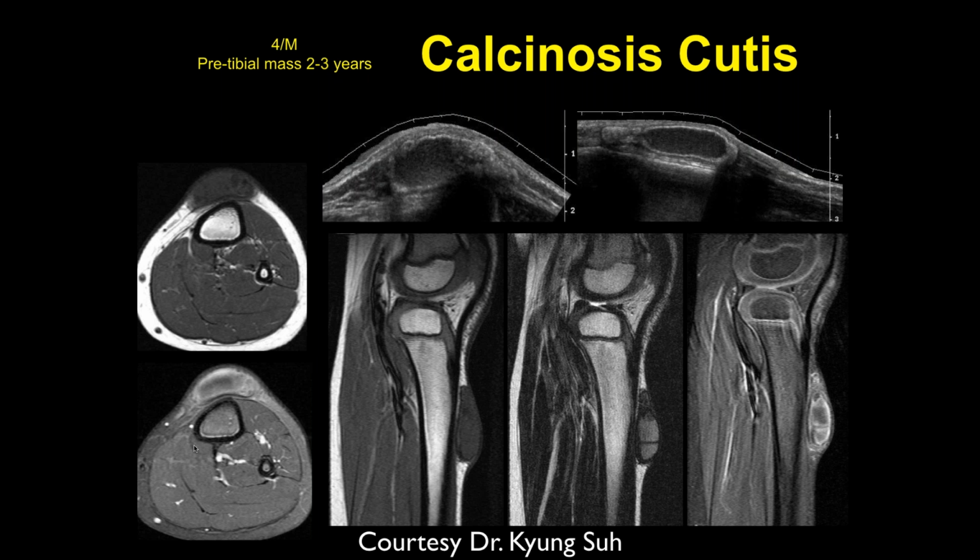I wonder if anybody's ever researched a 4-year-old having a Morel-type lesion. I would imagine a contusion with a collection of blood, a hematoma, could produce this kind of picture, but Morels don't go away that I know of. Yeah, but this is really centered in the fat rather than at the interface with the deep fascia. Well, this is going right to the periosteum, isn't it? From periosteum to the epidermis, right? Right.